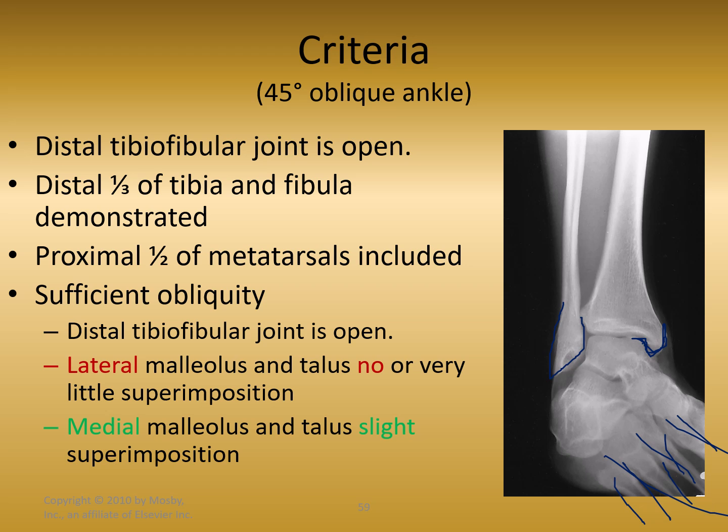So it says here that the lateral malleolus, let's go ahead and put it in red here, the lateral malleolus and the talus, no or very little superimposition on the lateral side, but some more, slight superimposition on the medial side here at the medial malleolus of the tibia. And we're talking about superimposition on the talus itself.